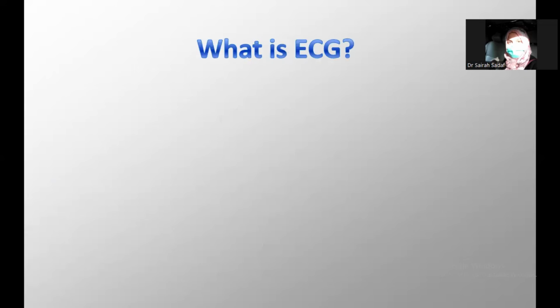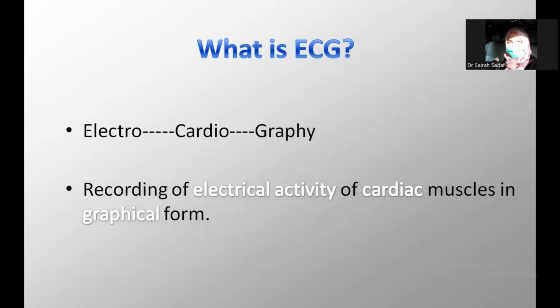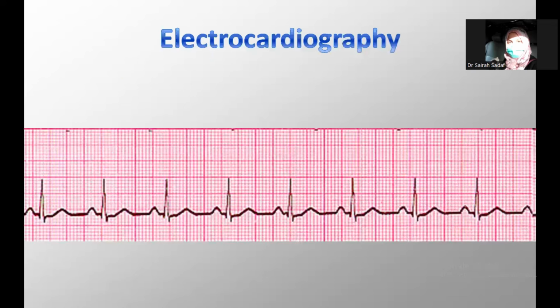So starting from the very basics, what is ECG? It's the abbreviation of electrocardiography. I hope everyone is familiar with that. And basically it's the recording of electrical activity of the cardiac muscle or the myocardium in the graphical form. Now this is a very typical tracing of ECG. All of you are familiar with.